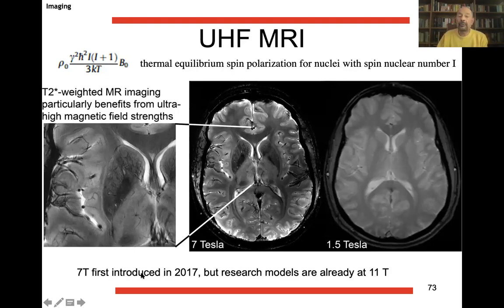7 Tesla was actually introduced in 2017. It's not everywhere, but there are several hospitals. Research models are already working at 11 Tesla. So this is quickly growing.